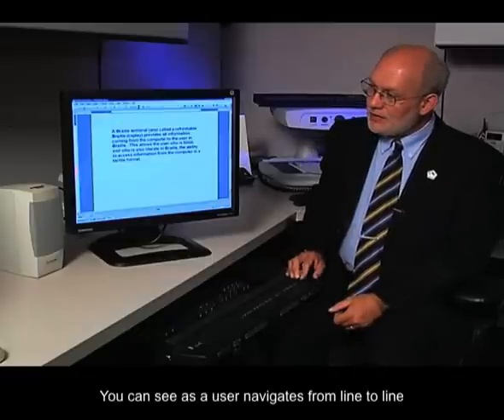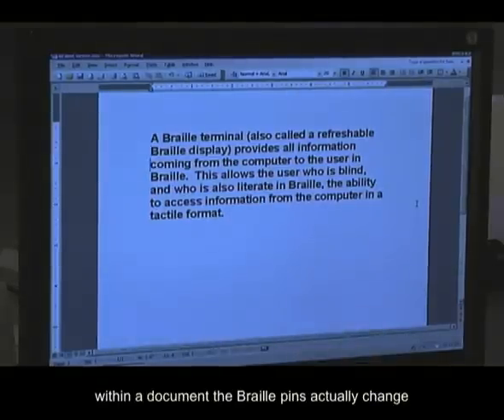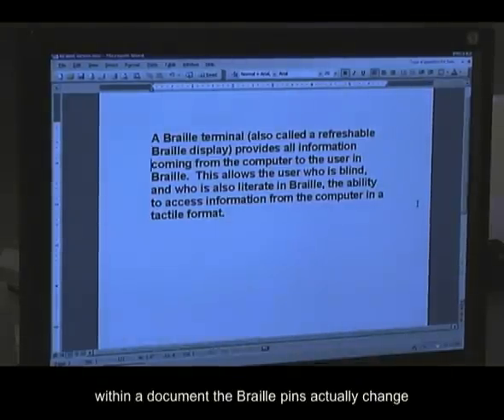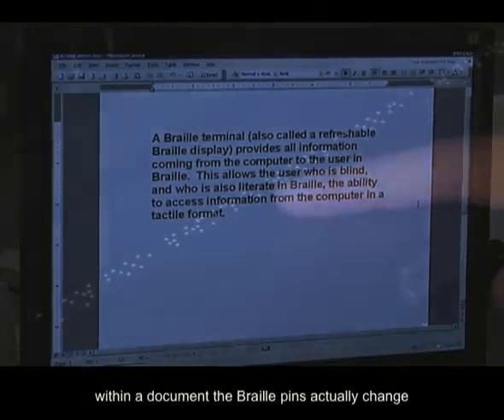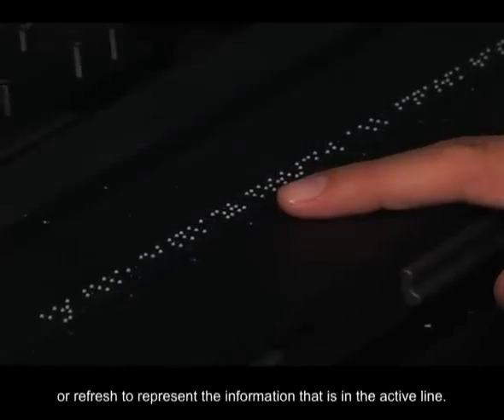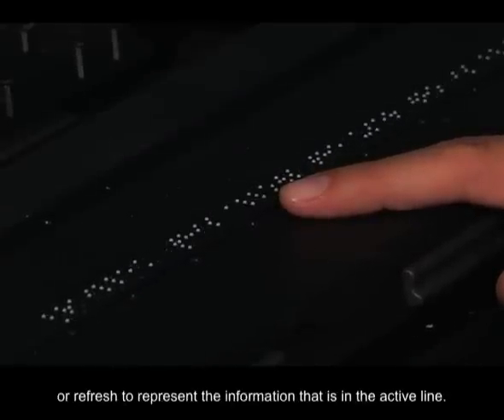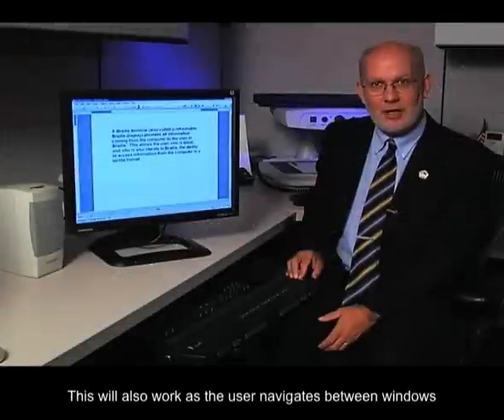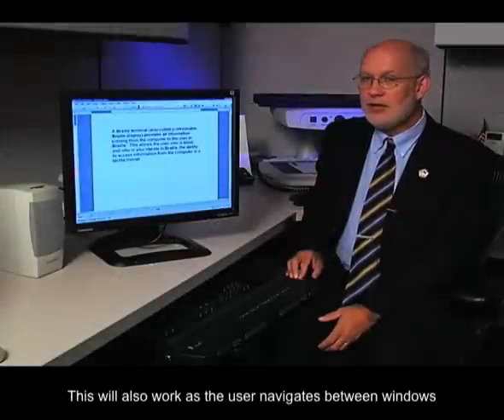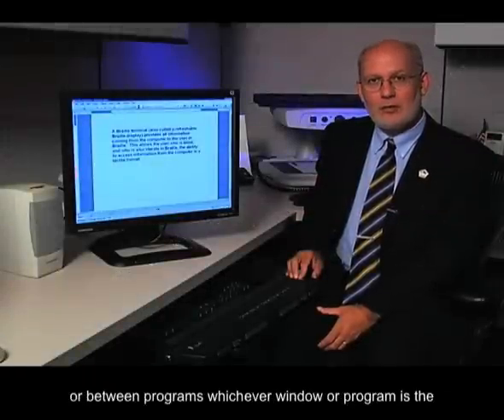You can see as a user navigates from line to line within a document, the Braille pins actually change or refresh to represent the information that is in the active line. This will also work as the user navigates between windows or between programs.